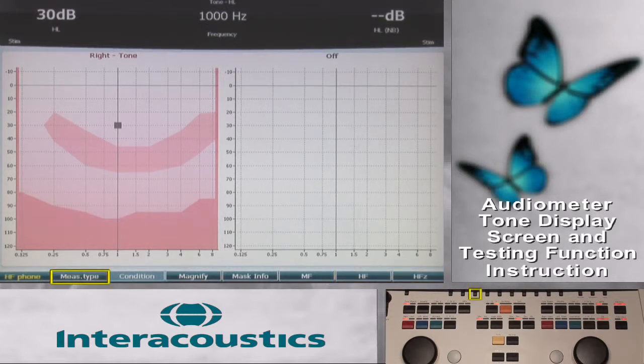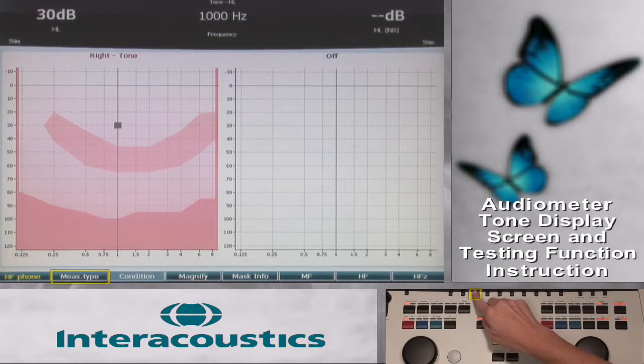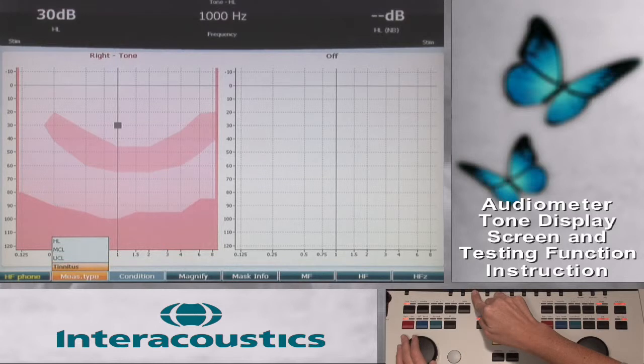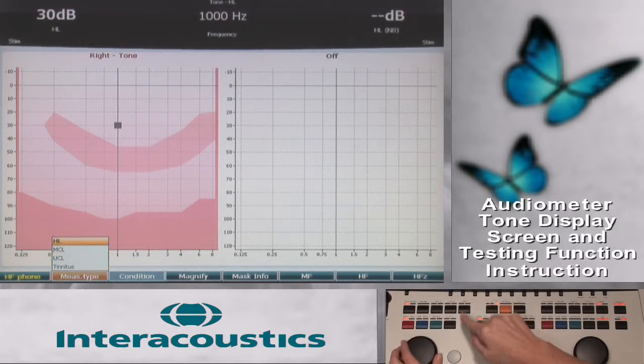The Measure Type function key specifies the test performed so that the correct symbol will be stored on the audiogram. This must be selected prior to storing the results.